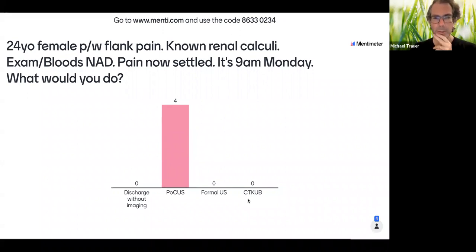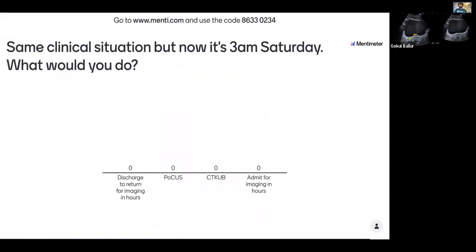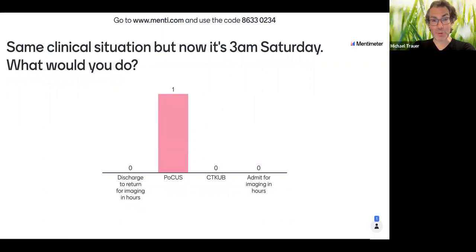Okay, let me give you one slightly different scenario then. It's the same clinical situation, but now it's after hours. Well, I guess this is not going to change your decision because you're all going to do a point of care scan anyway.